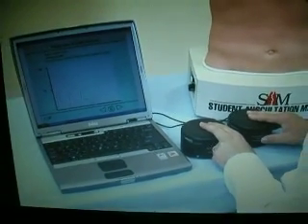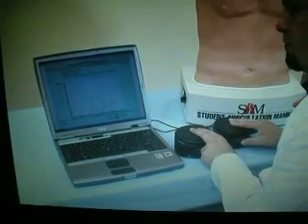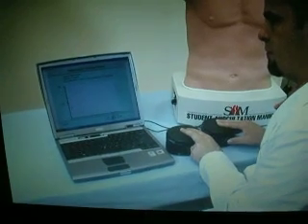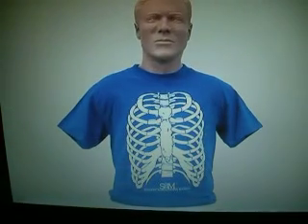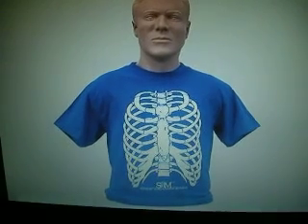The system teaches rate, rhythm, kinetics, profile, or shape and timing. This is an essential skill that will be used throughout the student's medical career. Auscultation is a fundamental skill that takes time, practice, and patience to master.